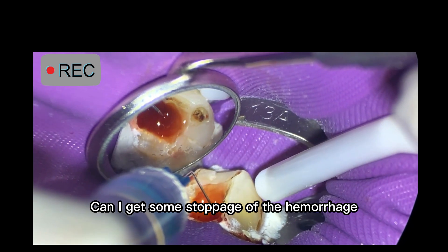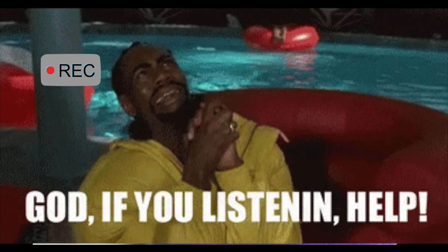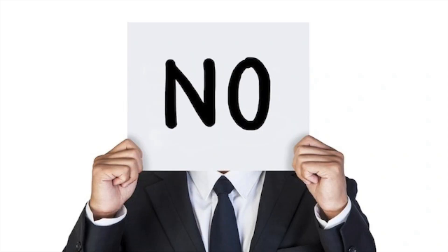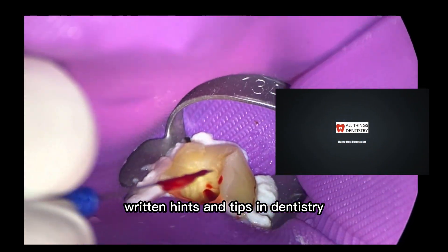Can I get some stoppage of the hemorrhage by just irrigating? The answer's no. This is Ash from All Things Dentistry, the place where we're passionate about sharing the unwritten hints and tips of dentistry.